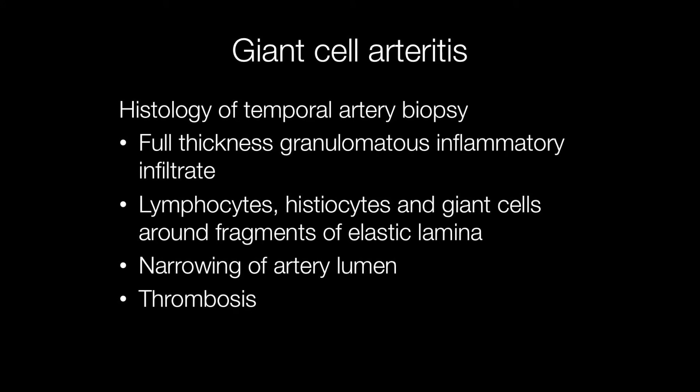Histological features of giant cell arteritis include full thickness granulomatous inflammation of the artery wall. There are lymphocytes, histiocytes, and of course giant cells, as the name implies. The giant cells tend to be situated around fragments of disrupted elastic lamina. In addition, there may be narrowing of the lumen of the artery and thrombosis.